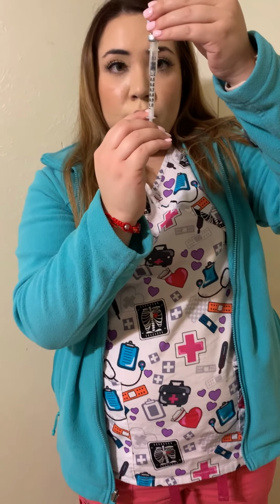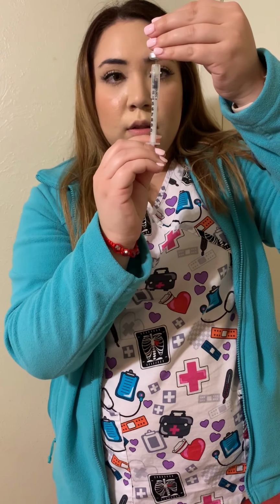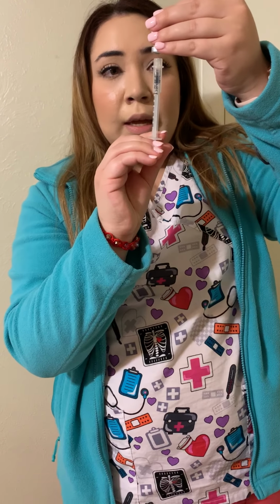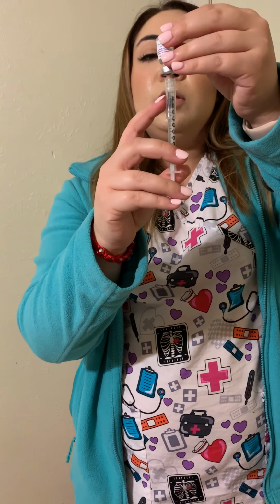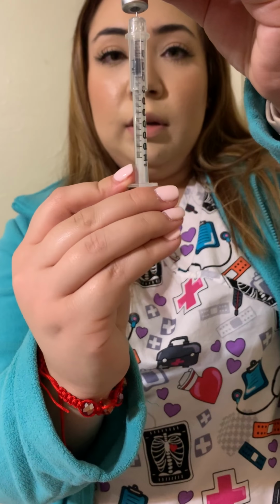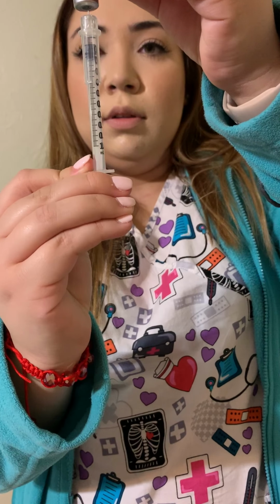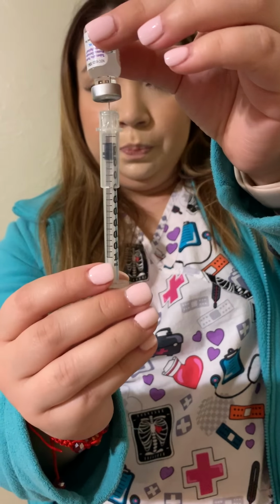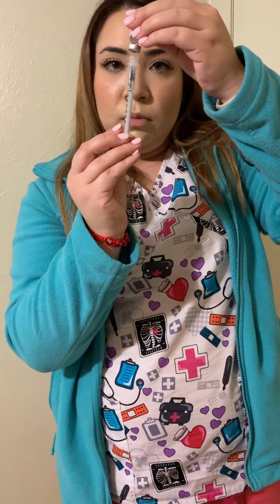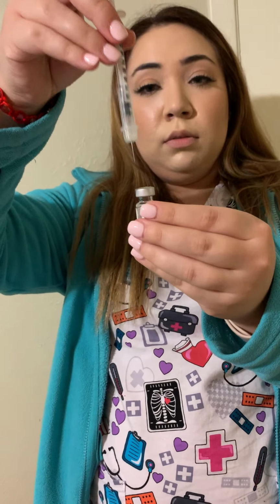And we're going to draw back the 0.1 mLs. Now, if you have a little bubble at the top, that's okay. You can always draw back more and eventually just push it back into the vial until you get the 0.1, like so. Okay, so we're going to then flip the needle.